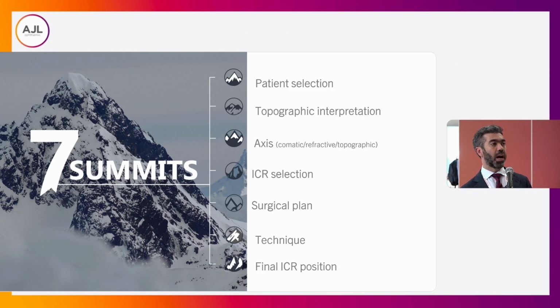Then once you have done that identification of the axis, you can choose the intracorneal ring, make the surgical plan, and then the technique is always the same, but with these intracorneal rings you will have some different specifications.